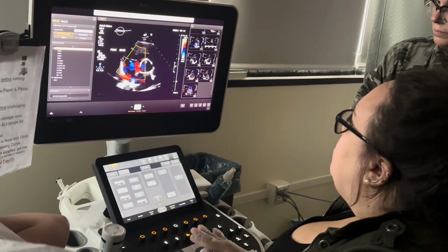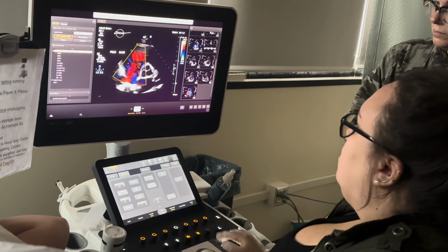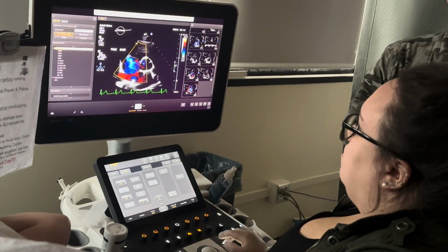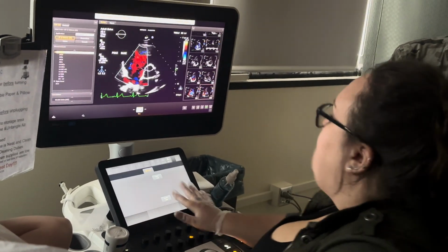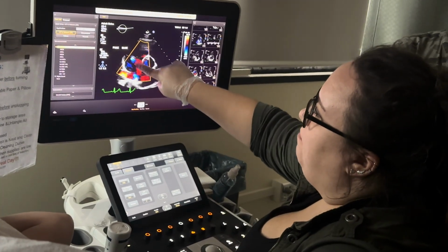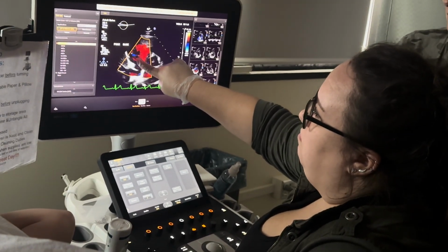And then we'll do tricuspid. I don't understand the color. You're not going to understand it yet. It just looks so chaotic. I don't see how you can tell where exactly everything is. It's going to be a little bit. That blue blip, that's TR.